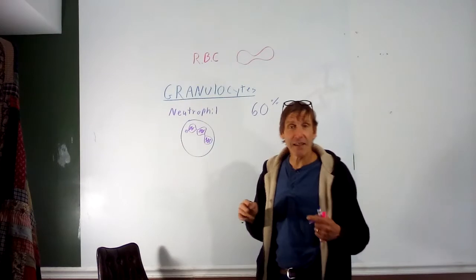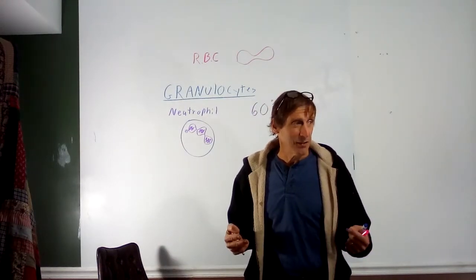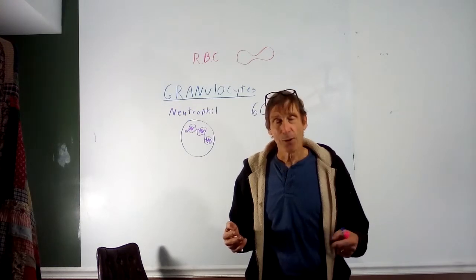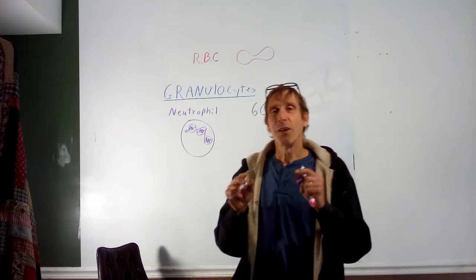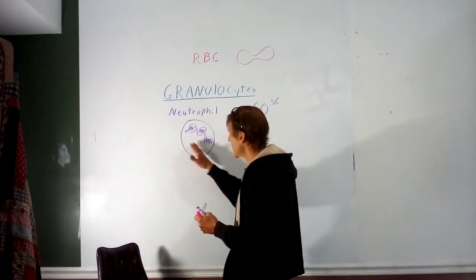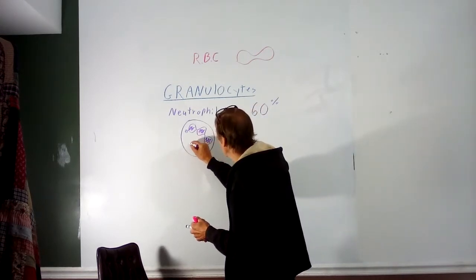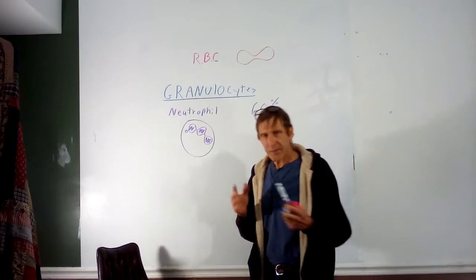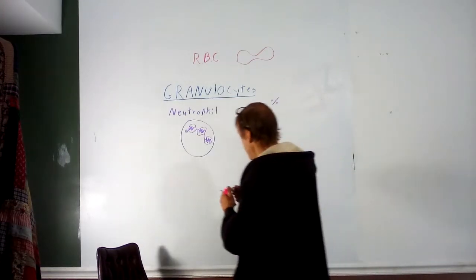These are granulocytes, but on the magnification we use, a 40 power objective lens, we have a total of 400 magnifications. You can't really see the granules. They're so fine, they don't resolve with the systems we're using. So you won't see much in the cytoplasm. There's some really fine inclusions, that's about it. So that's the neutrophils, you'll see boatloads of them. The next one.